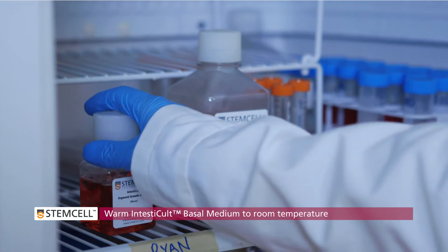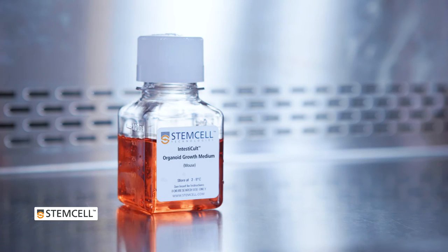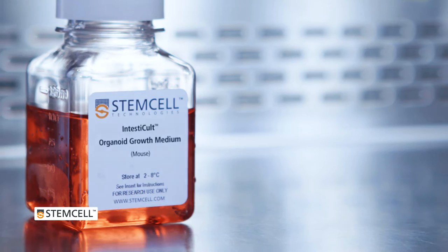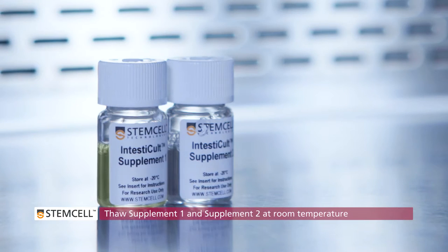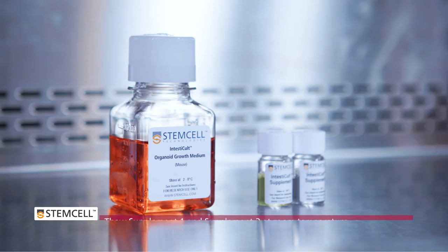Before you begin, remove the bottle of Intesticult Basal Medium from the refrigerator and place on the bench top to warm to room temperature. Remove the vials of Intesticult Organoid Supplement 1 and Supplement 2 from the freezer and leave them to thaw at room temperature.